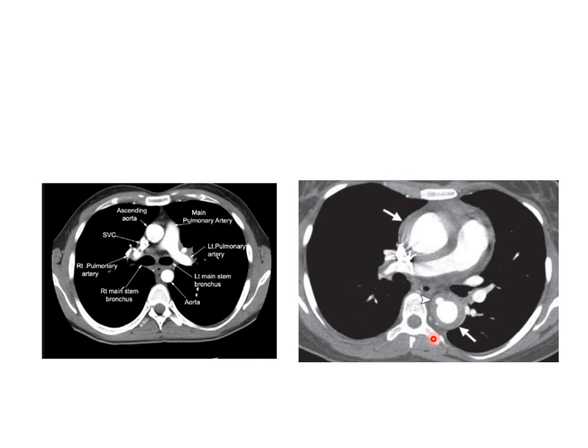So if we want to compare which is most important, conventional angio or CT angio and MR angio, as an initial evaluation for diseases of the aorta, it's of course CT angio and MR angio. Why? Simply conventional angio is invasive with radiation more than CT.